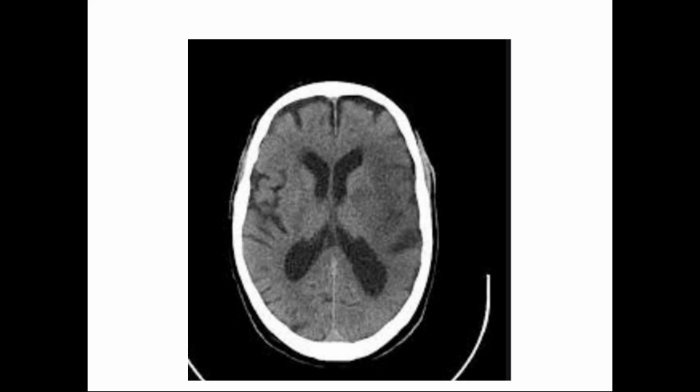And patients usually presenting with hemorrhagic strokes are usually not so compliant, and they might be moving. Performing an MRI scan will take more time, and if we need a fast diagnosis and fast scan, we go for a CT, and we can rule out hemorrhage in CT as it is easily identified as a hyperdense structure, hyperdense attenuation within the brain, which is a bright structure.